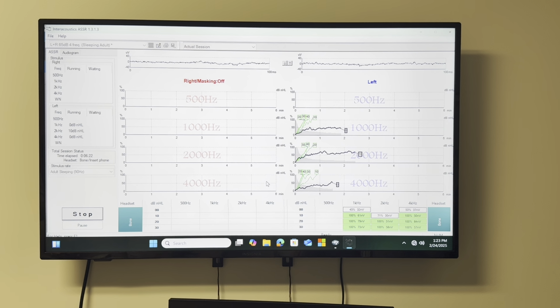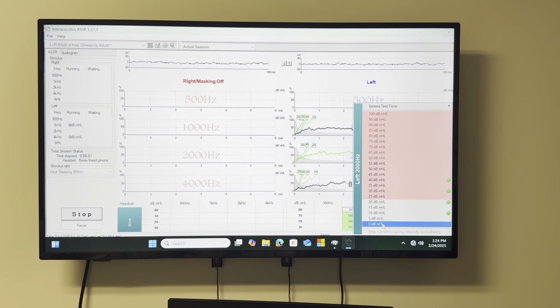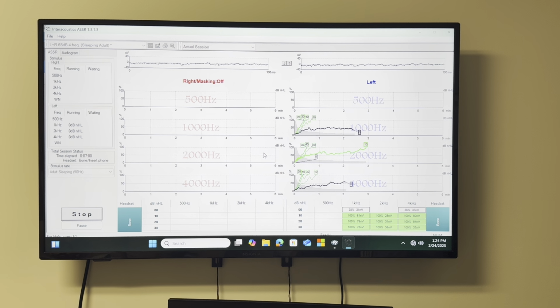Oh, why? The electrode is close. Oh, so that's what I asked, okay. Even with air conduction, you're playing the sound here, the electrode could be here, but the bone oscillator is driven at very high voltage. It's driving the bone, so there are high voltage changes going on, and that has been picked up. Even with air conduction, it's a problem at about 90. So one of you can do a project looking at 10 deaf individuals, doing high intensity air conduction and high intensity bone conduction to see what the problems are.